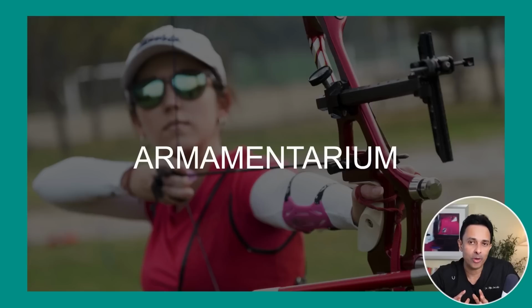And in our opinion, we should always use the CBCT in virtually every single case of retreatment, and especially in cases of MB2, because it's always good to know in advance whether or not there's a missed canal before going around looking for it. So let's talk about armamentarium. When we talk about locating MB2s, it's always good to have certain tools in our clinic. And let's look at some of these tools.